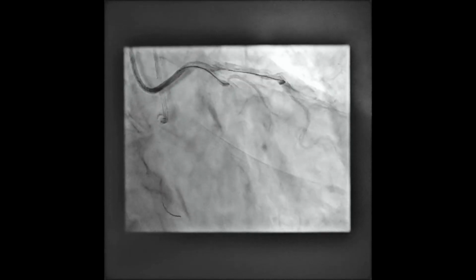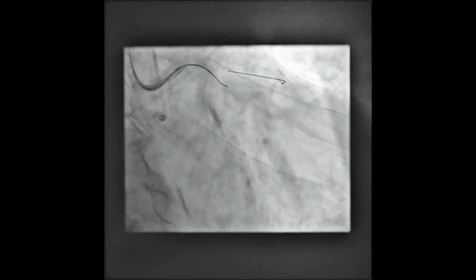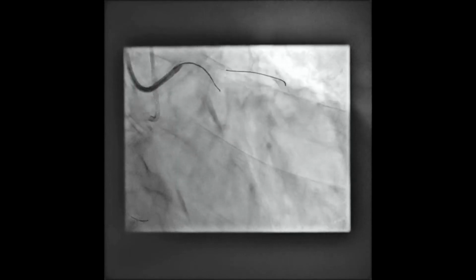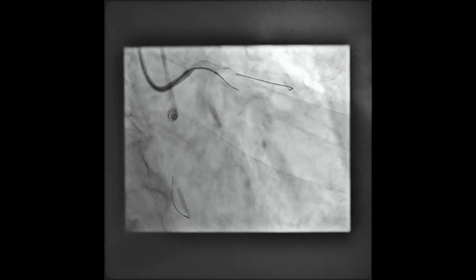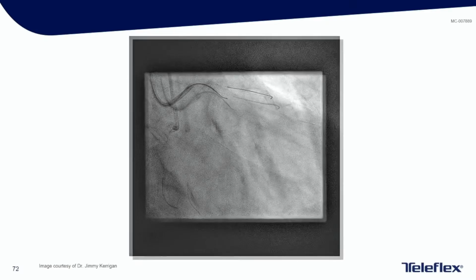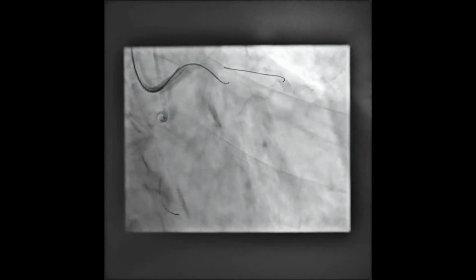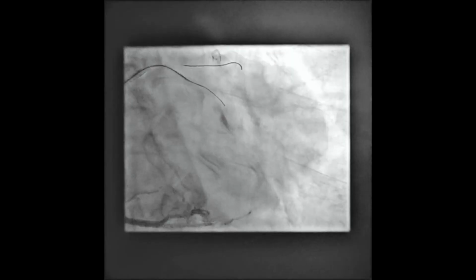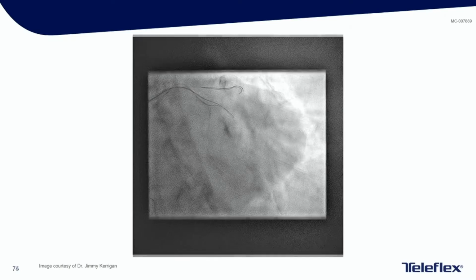And again, once the wire gets into the occluded segment, you'll see that we're not injecting very briskly into the coronary artery because we don't want to extend any dissection flap, because we probably would be extraplaque at some point along the way, and usually we are. So the antegrade wire moves through the vessel. In the interest of time, I'll skip you watching me wire the wrong spot a couple of times. On retrograde injection, it looks like we're heading the right way.